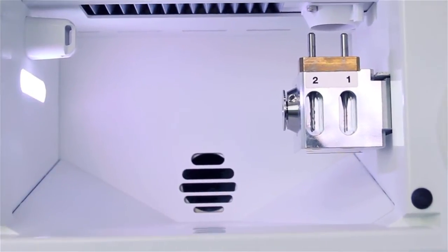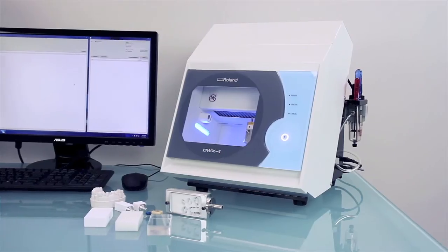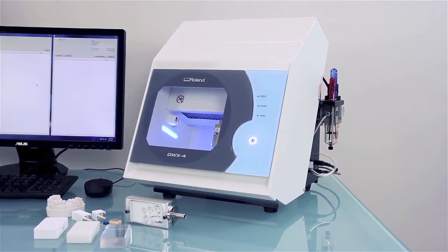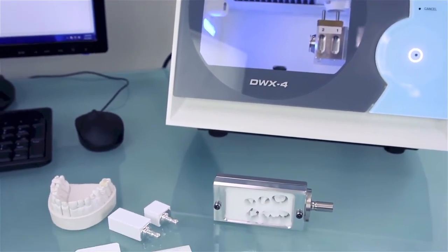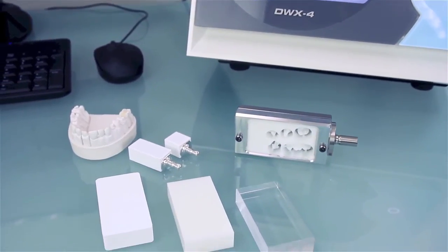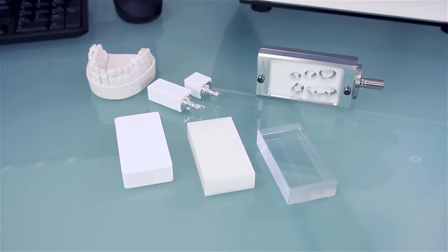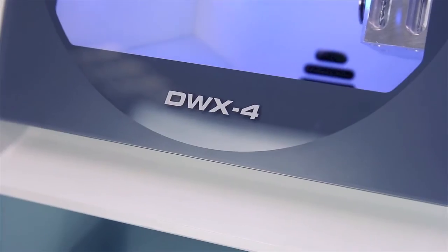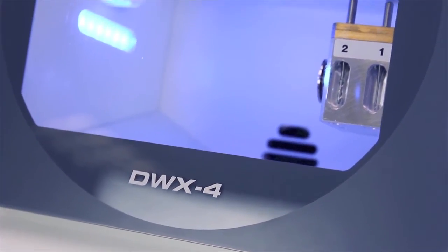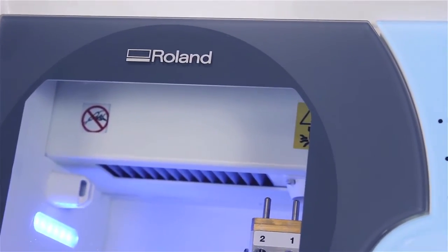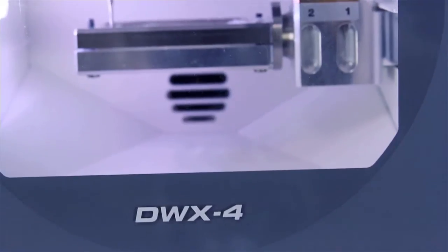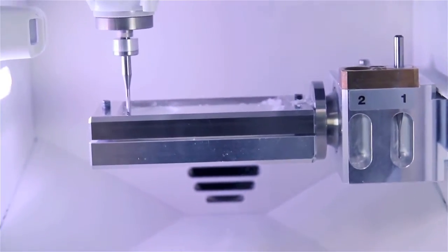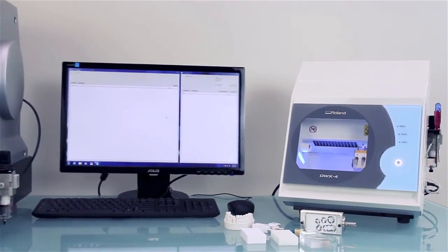The DWX4's open architecture means you are always able to work with the latest milling materials and software. If you already have a digital production solution, the DWX4 works seamlessly with your existing dental scanner and compatible software, nor will you be forced to rely on a single source for materials.